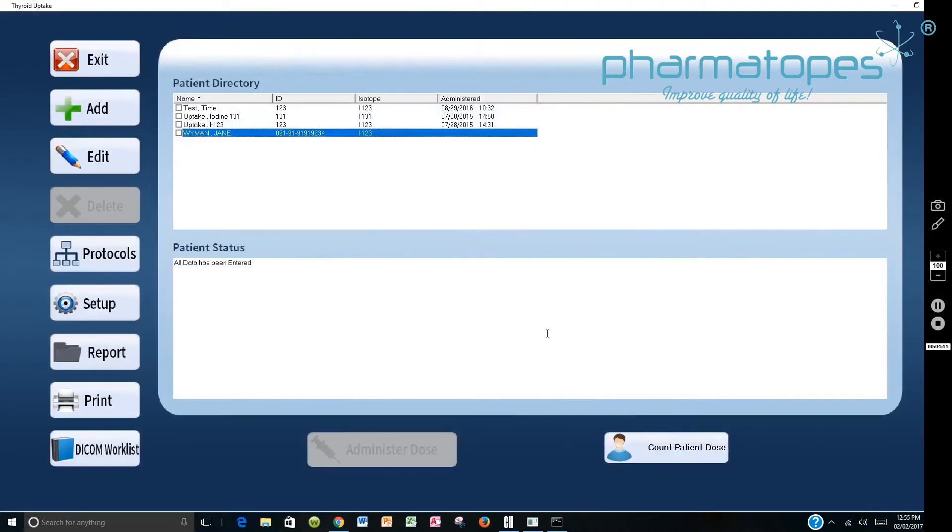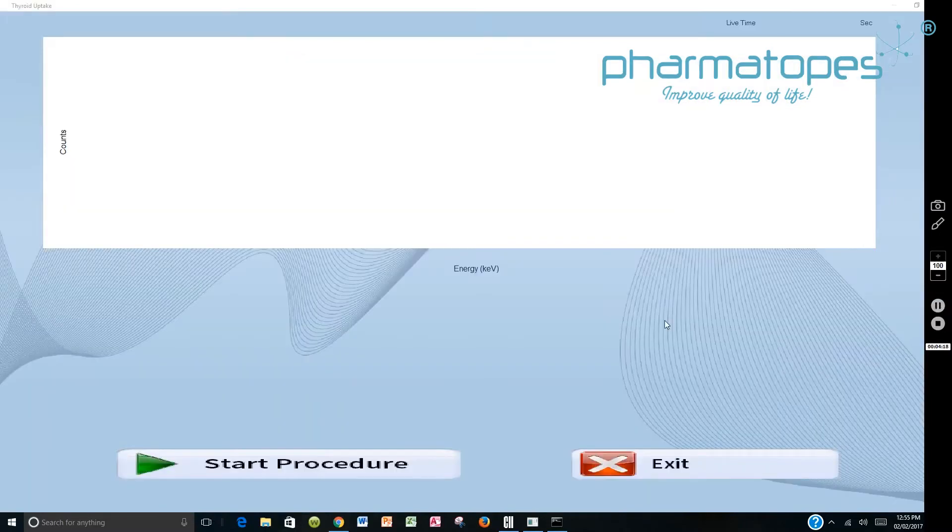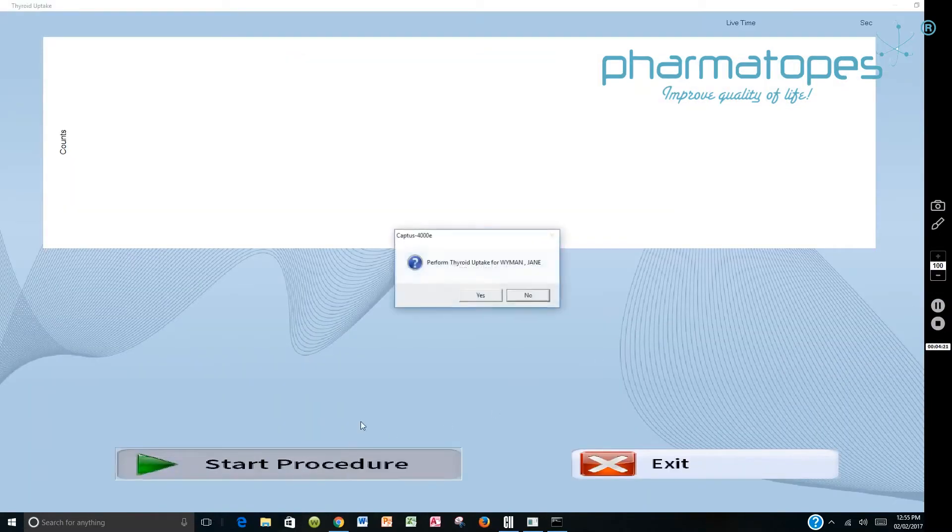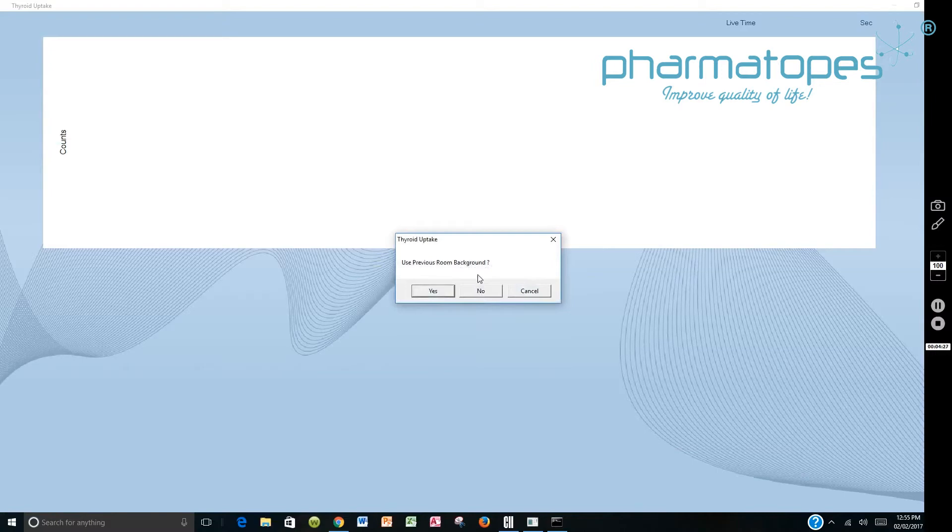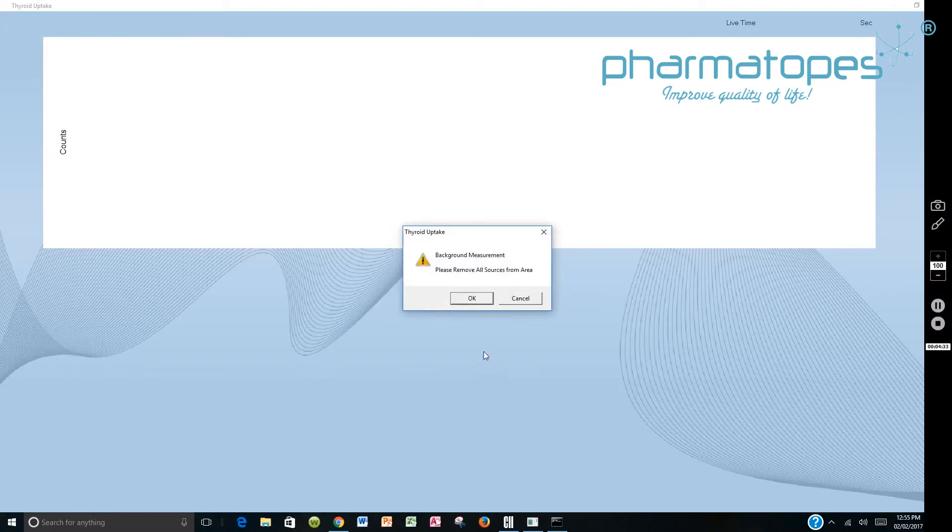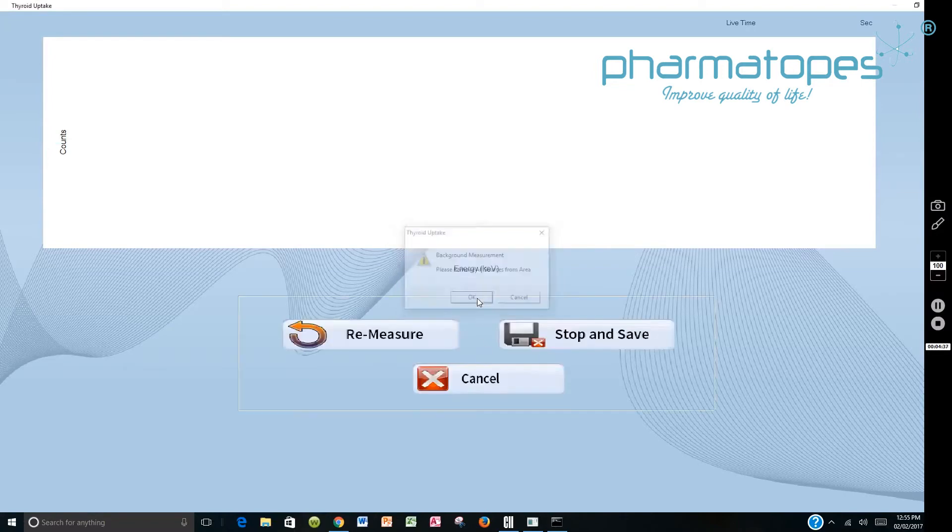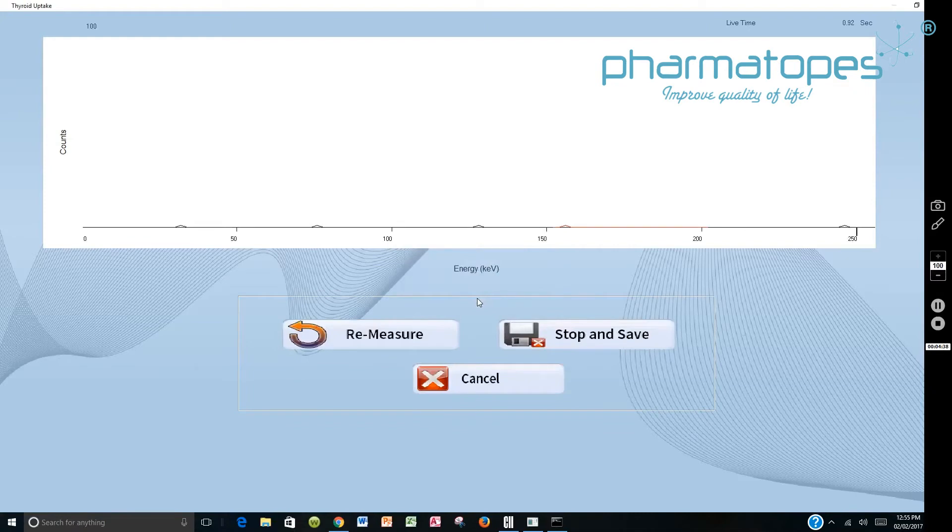So now all data has been entered. So we're ready to count the patient dose. When we're ready to count the patient dose, this screen comes up. It tells you this is the patient you want to do. And you're going to say yes to that. And it says do you want to use the previous room background? If it has one, if not, just say no. You want to count the background. So you remove all the sources from the area and you start counting the background.